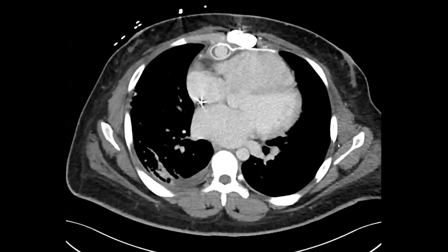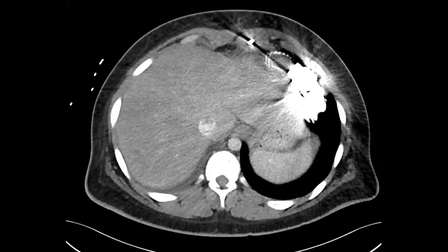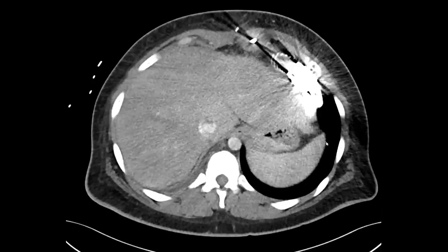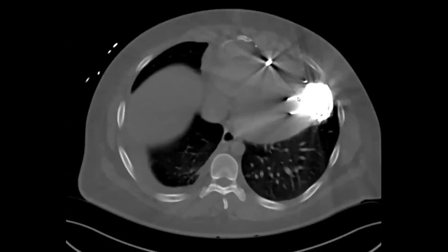Now, what is all this metallic artifact? What does this patient have in their heart? A left ventricular assist device — yes, excellent. So we can see it's basically pumping blood from the ventricle through the outflow channel.